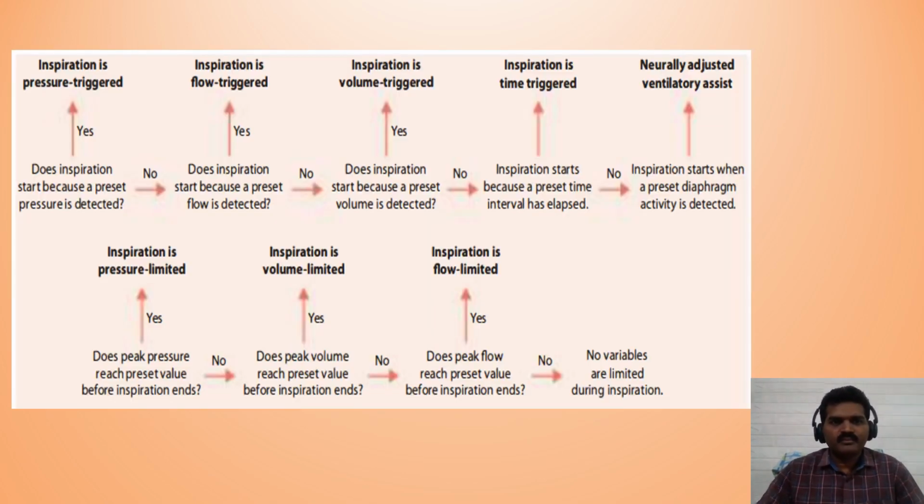Does the patient start the breath because a preset pressure is detected? Then inspiration is pressure triggered. No. Does the inspiration start because a preset flow is detected? Yes, the inspiration is flow triggered.